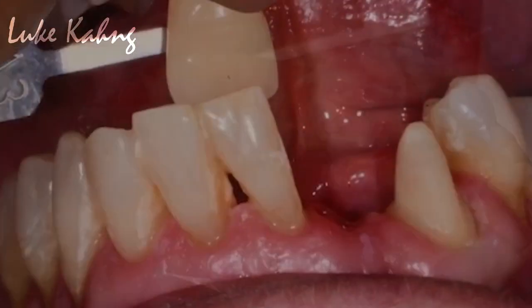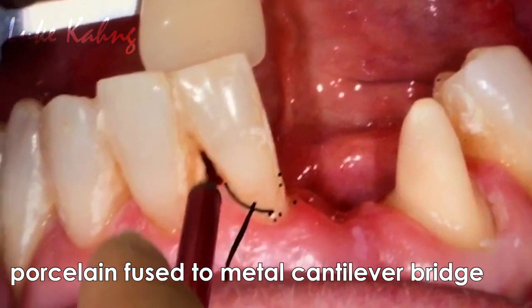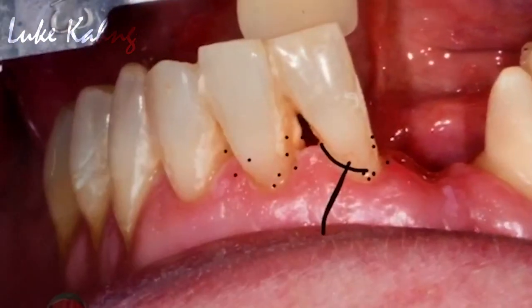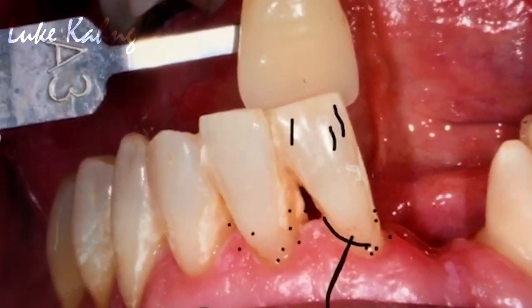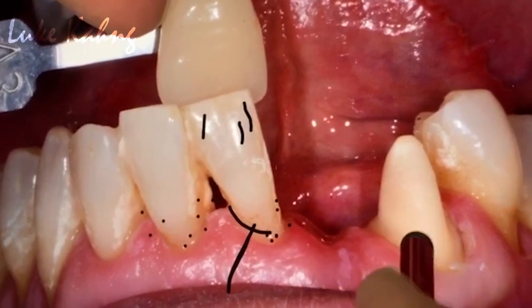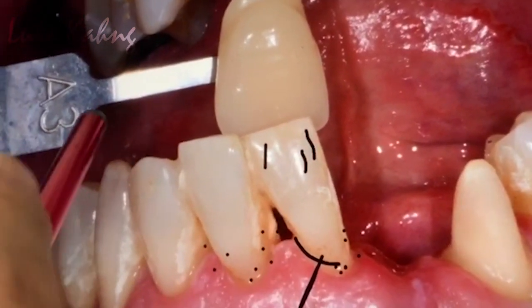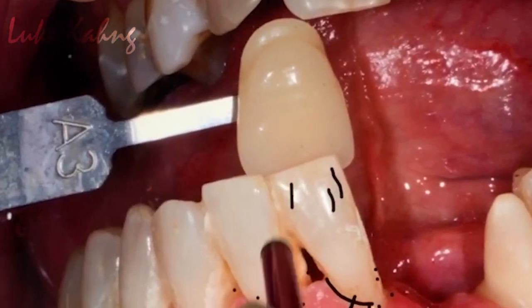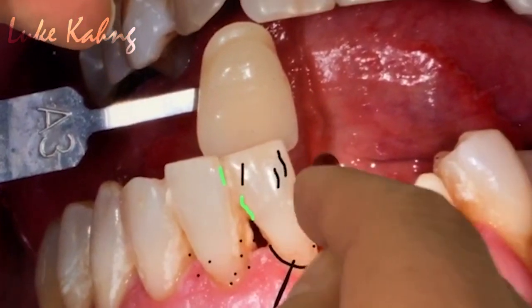Nice. So now I have to take a look at it about subtle stain in between tooth. And then here is a little bit more white calcification. Here is a little bit of an issue. This is after prep, meaning already dehydrated, so darker than this. But the doctor put A3 and A2. And also I have to figure out a little bit more color in the embrasure.